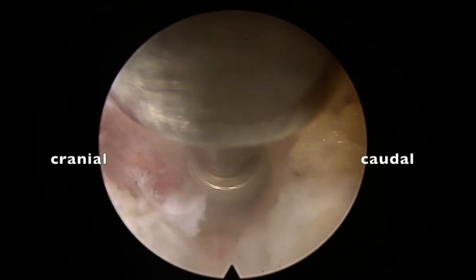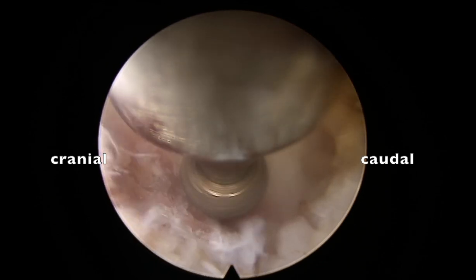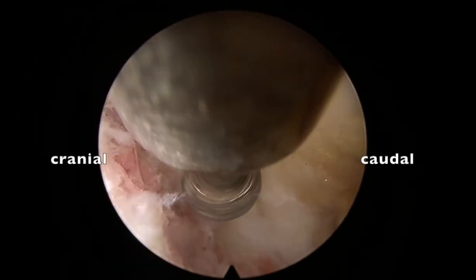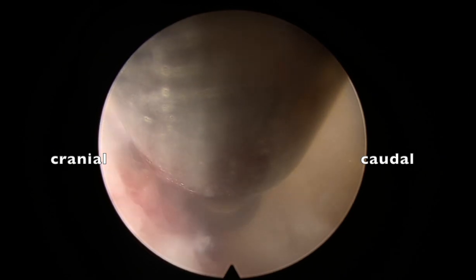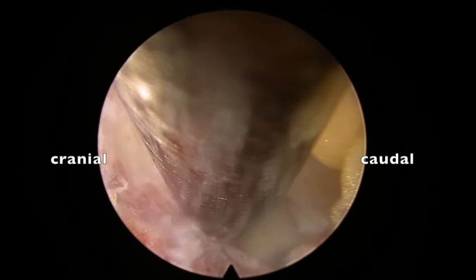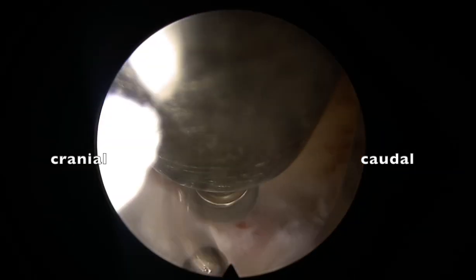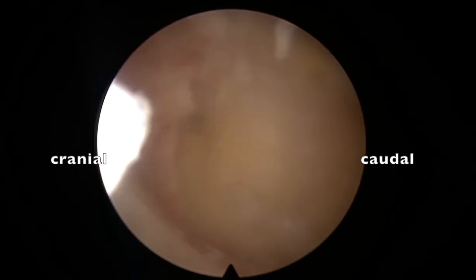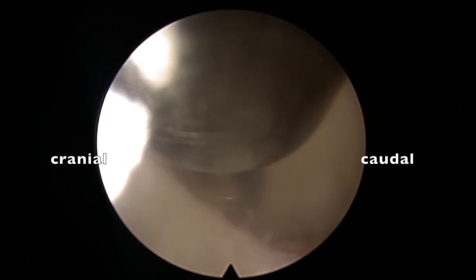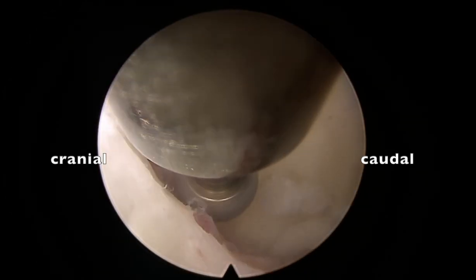Here I am again delineating the edge of the facet. There is always a debate about how much facet should be drilled at L4-L5. Correlate on MRI how much the superior facet is overhanging in that area — that decides our endpoint of drilling. Here the superior facet is slightly overhanging, so we need to reach till the medial border of the superior facet. Once that is seen, that is the endpoint.